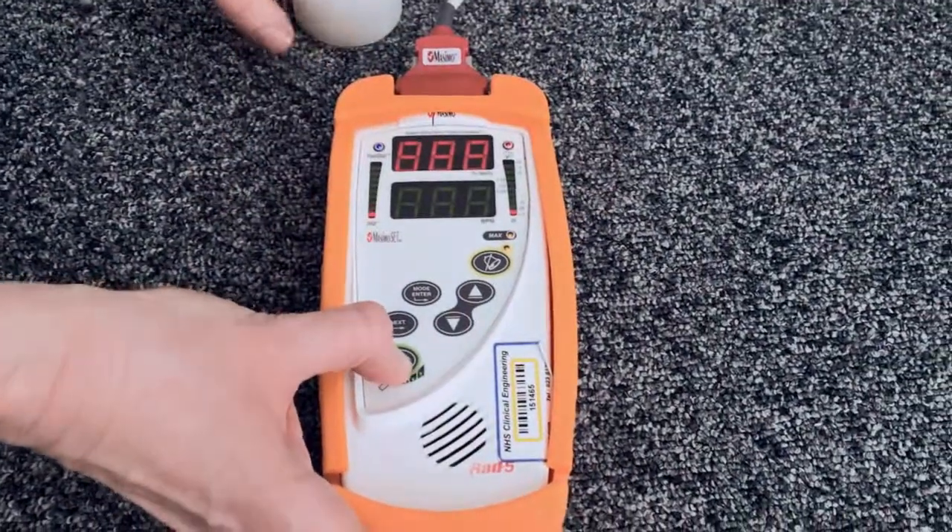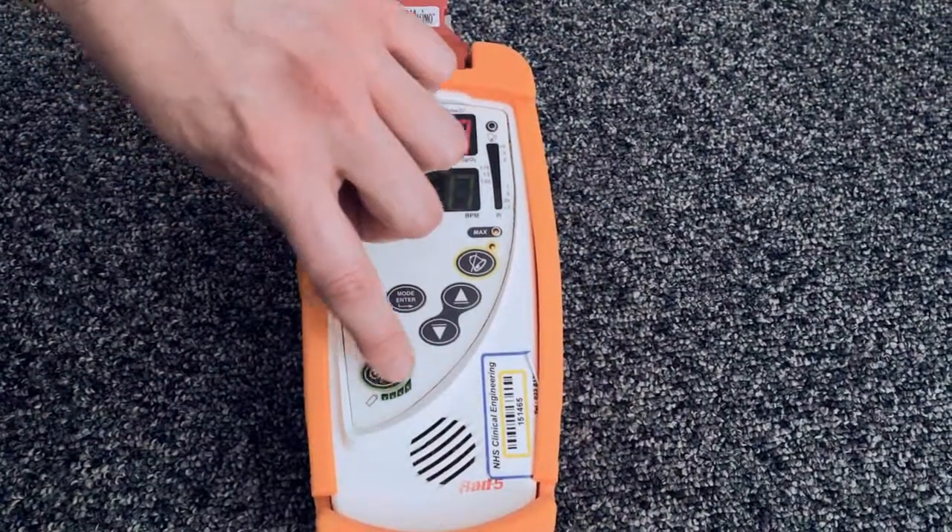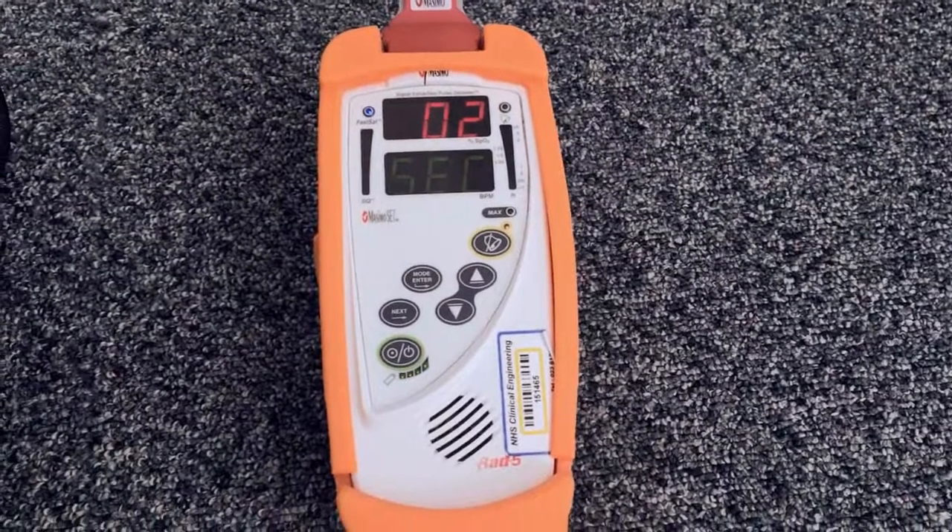When you turn the machine back on, you should have four bars displayed, which shows that the batteries are now fully charged.